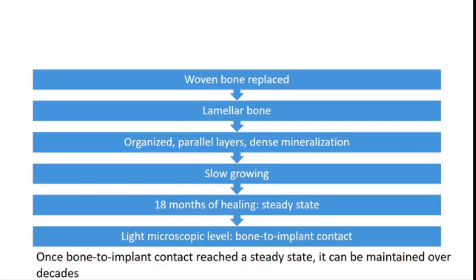But clinically, approximately, like fracture of a bone, it takes about 4 to 6 weeks to heal. The same way in implants, after the initial placement of the first component of the implant, the loading can be done only after 2 to 3 months.